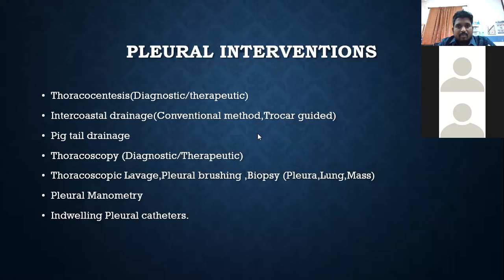even in pleural fluid conventional cytology, if you are getting the fluid after aspiration, there is a chance that you may get a negative result even though the patient is having malignancy. Whereas in thoracoscopic lavage, after putting the saline into the pleura, you can make the cells shed after the wash. So instead of already shed pleural cells in the pleural fluid, you can have fresh cells after putting in a lavage, which will give more yield when compared to conventional cytology.